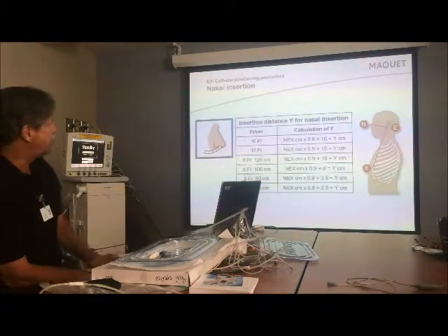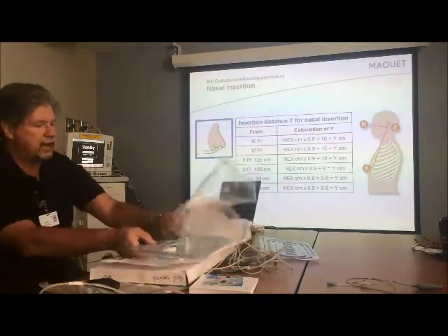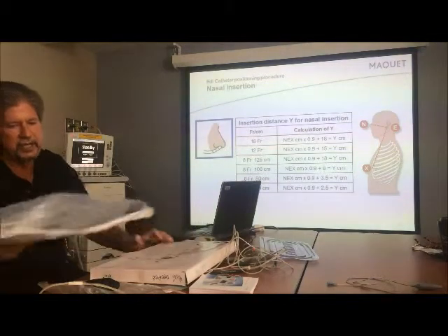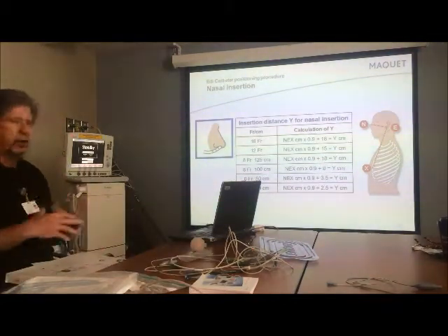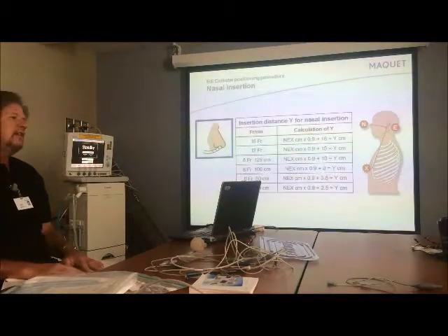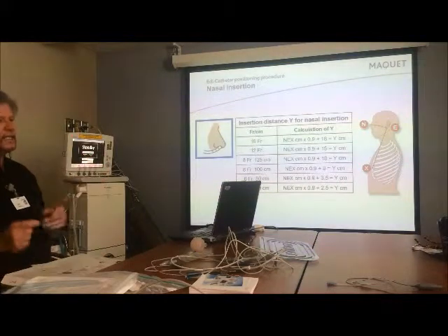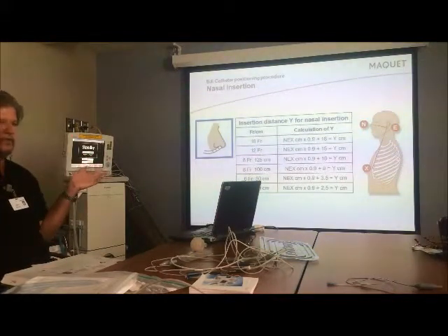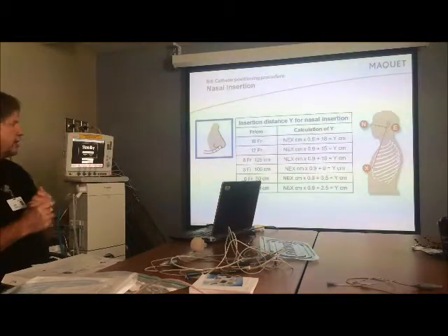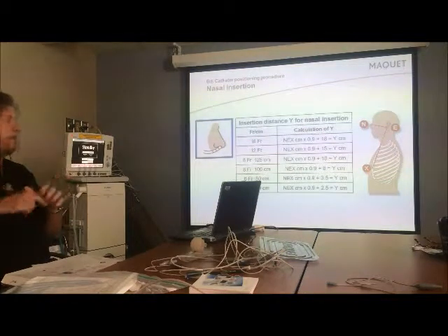And then what we're going to do is a little bit of a calculation initially, but as time goes on, you might not be doing this calculation. This is all part of the newbie in-servicing. The purpose of this calculation is, as I said, the nurse can just do nose, ear, xiphoid, put it in, and she's in position to feed with, and that might be all her concern is. But we want to make sure that the middle set of electrodes are at the level of the diaphragm.